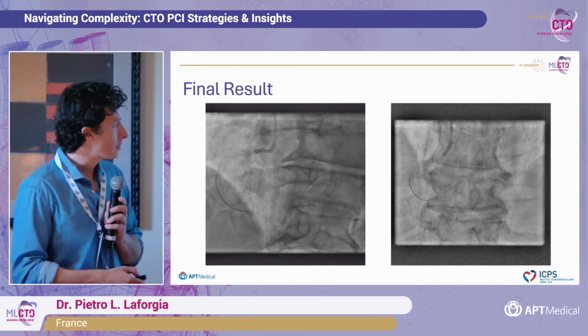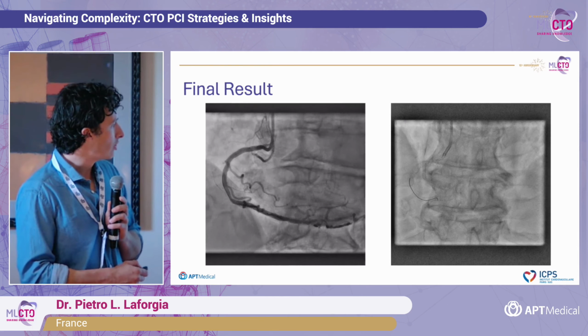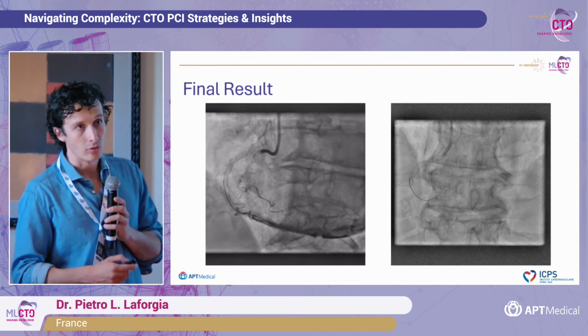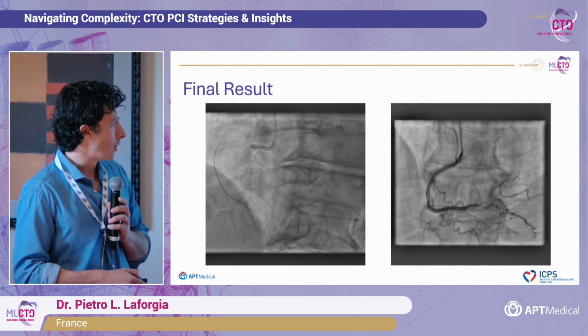And then the case was done relatively easily with some pre-dilatation. We did some Shockwave on the calcified nodule, and the result was good. You can see here the final result as well.